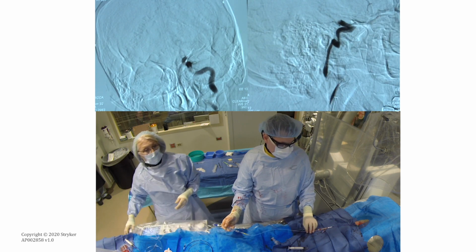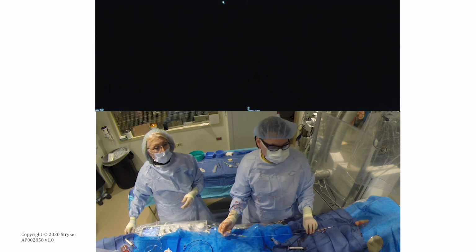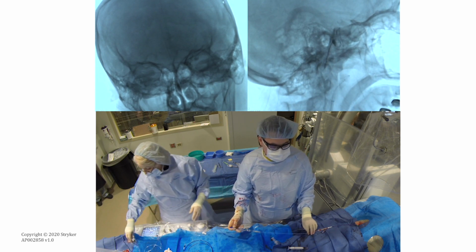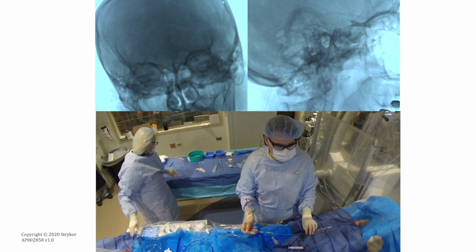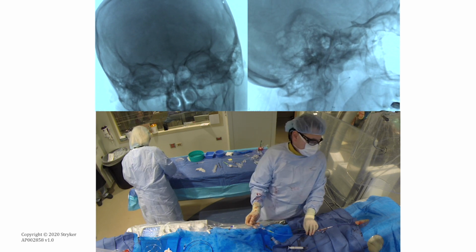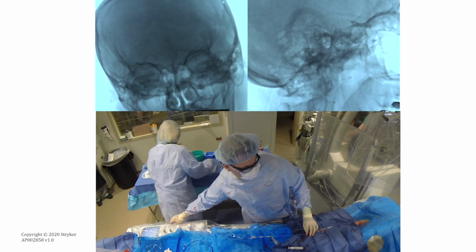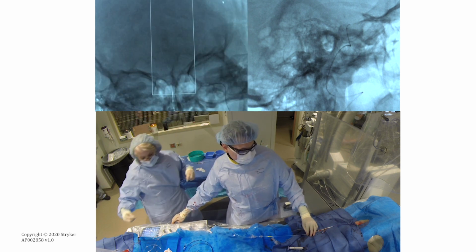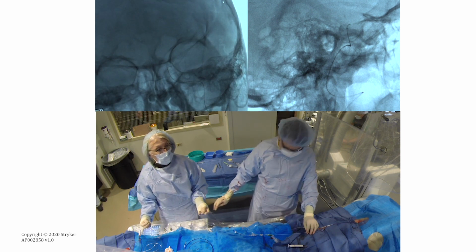Here you can see that we have an idea of the anatomy and where the occlusion is. On AP and lateral, we use the Synchro Support wire, which has been really helpful to get into the place we want with the support we need, without losing the navigability we're used to with the Synchro wire. You can also see that I have a torquer on the wire, as well as a gentle J shape at the tip.